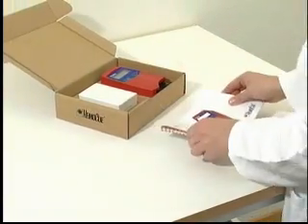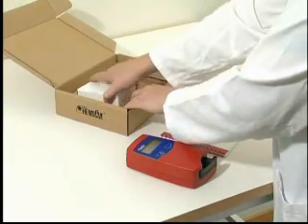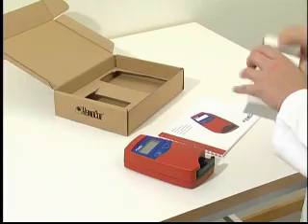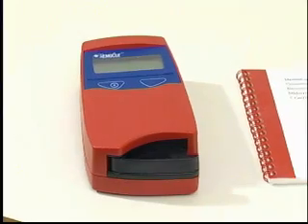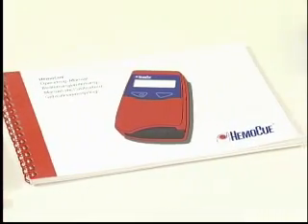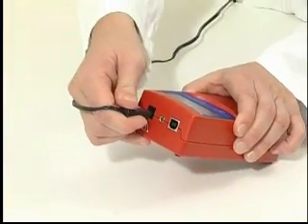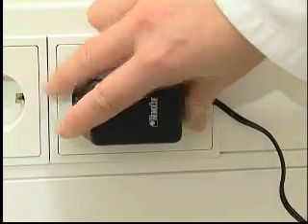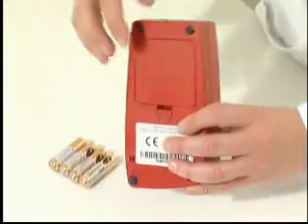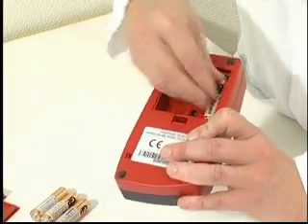The HemoCue Glucose 201 Plus analyzer and its mains adapter are delivered in a carton. Open the carton on a stable surface and lift out the instrument and accessories. If mains power is available, connect the adapter to the socket on the back of the analyzer. If mains power is not available, insert the four AA or R6 batteries into the battery compartment.